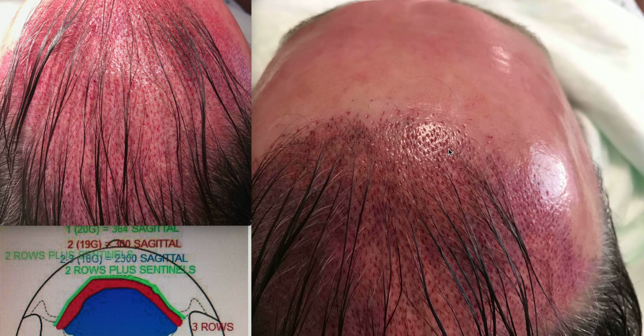You're also noticing a slight convergence. What convergence essentially means is the hair sites are going toward the center of the scalp. I don't know if you can see that. Slight convergence. You don't want an aggressive convergence, a slight convergence. There's a couple reasons for the convergence. Number one is you want everything aiming toward the center. When the center is weak, the person feels like there's no results. You want to angle them toward the center to get the maximal aesthetic impact.